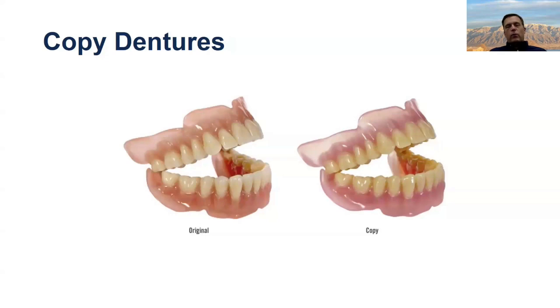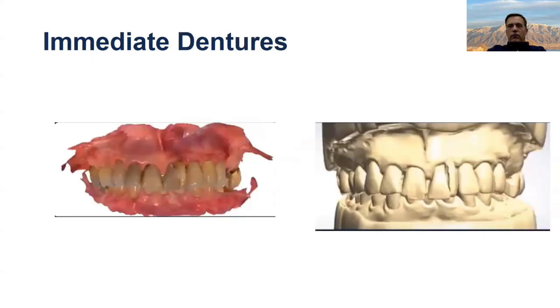Most of the time, if you're doing one of these cases, it would probably be good to do a reference denture workflow. In other words, to do the impression reline, just to make sure we're getting the most superior intaglio adaptation that we can. There's probably not a huge market for this, but it's good to have this in your back pocket and just keep in mind that this is a possibility for yourself.